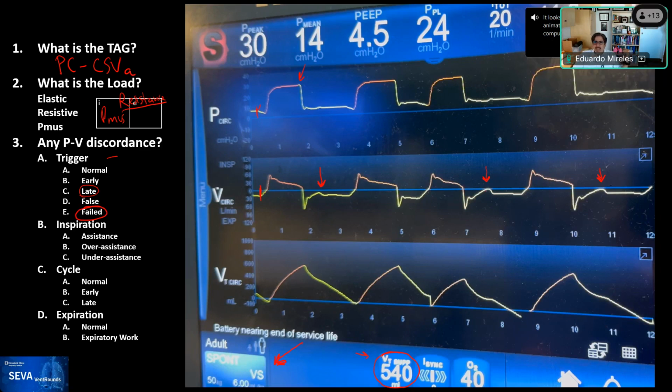So it may be good, but we need to understand how they work. You just asked the perfect question, which is what are we calculating? And from there, you can define the right place and the right patient in which you want to activate that button or not.